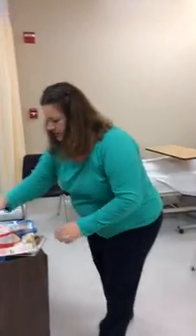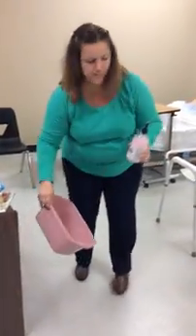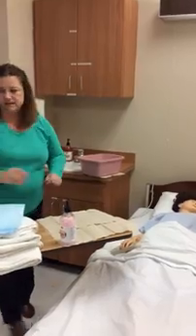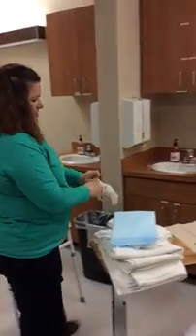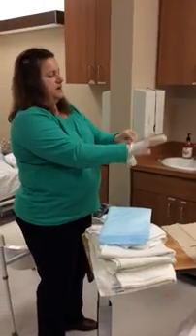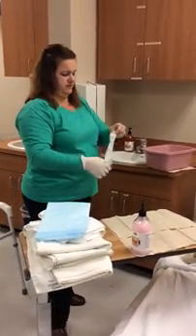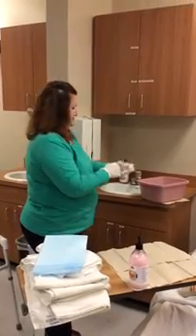I need soap. I need a basin. And I need gloves. Whenever you're doing a skill that requires water, you have to make sure that you allow your patient to test the temperature of the water. Before I put my gloves on, I would close my curtain, but for videoing purposes, I'm not closing the curtain right now.